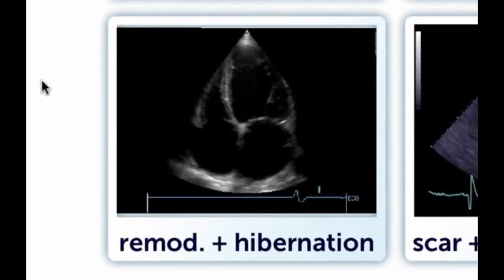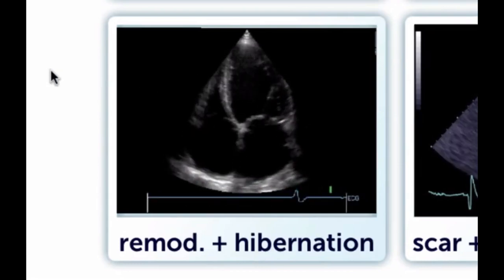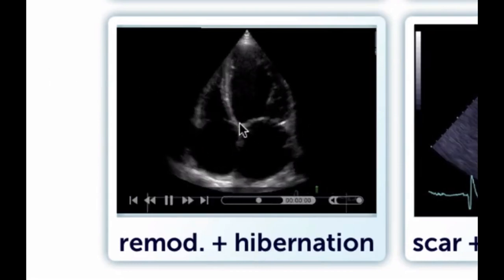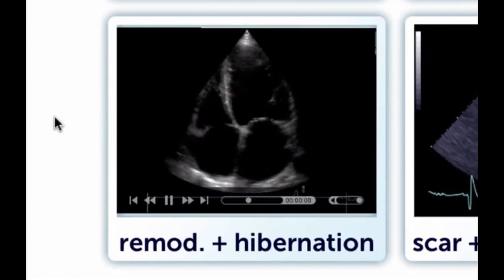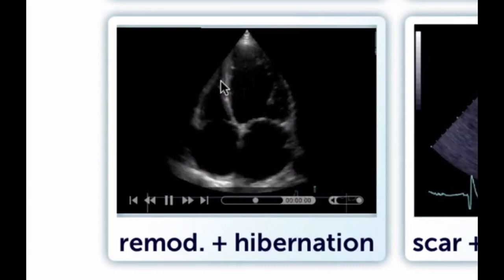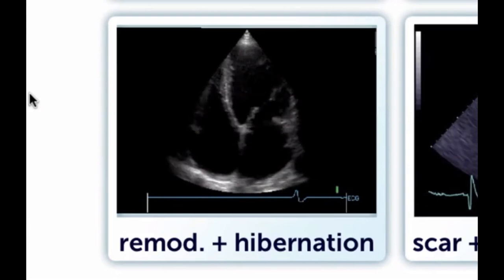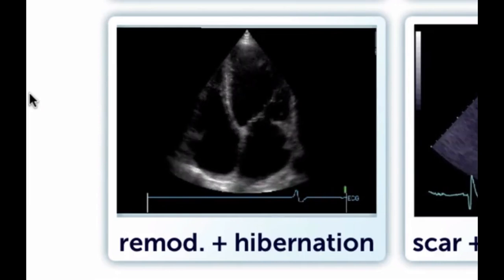This patient here had acute coronary syndrome many years ago, but now he presented with dyspnea. Taking a look at the echocardiogram, you will note that the patient has a severely reduced left ventricular function, that the patient has regional wall motion abnormalities, but the function is more diffusely reduced. But interestingly, we can find a normal thickness of the septum. So there is suspicion that the patient has some residual myocardial function, viability, and that was documented with other tests, and the patient eventually ended up having coronary bypass surgery, and he benefited significantly. Ventricular function improved after the procedure.